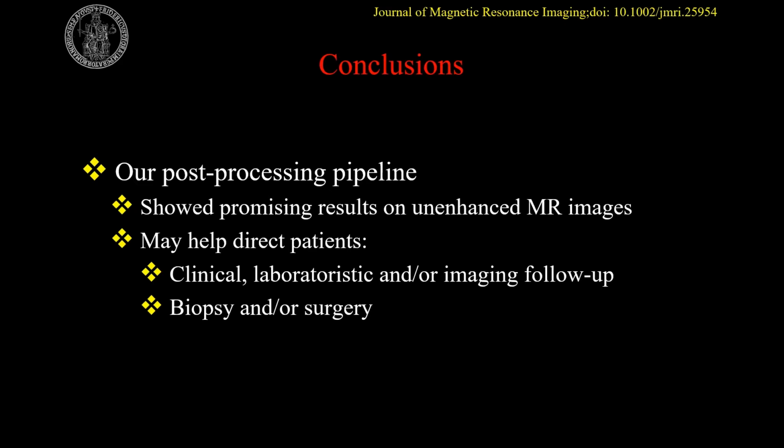Our post-processing software pipeline showed promising results on unenhanced MRI images in the characterization of adrenal lesions, especially nonadenomas. This in turn may help clinicians and radiologists to better direct patients in the management of these lesions towards a more conservative approach with clinical, laboratory, and imaging follow-up, or an interventional one with biopsy and/or surgery for lesions more suspect of not being lipid-rich or lipid-poor adenomas.